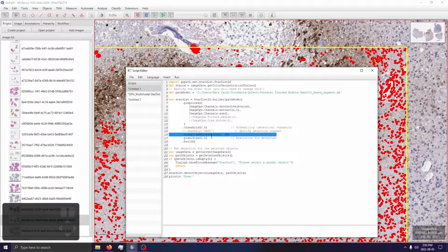And finally, normalization. Normalization is a big, big deal because after you perform the deconvolution, you now have basically this floating point data that can range anywhere from negative infinity to positive infinity. In reality, it's not that large of a range, but closer to like -1 to 2 or 3.